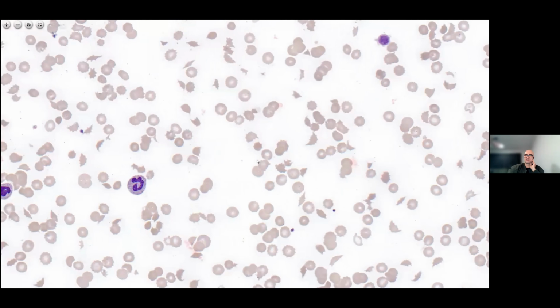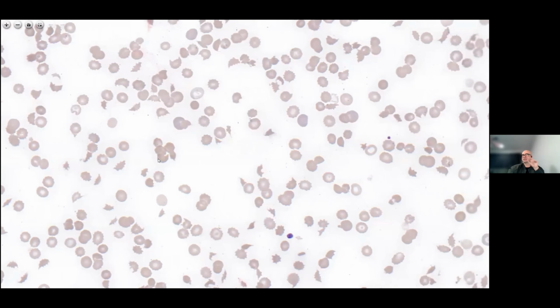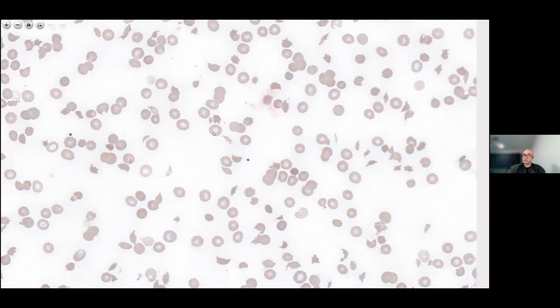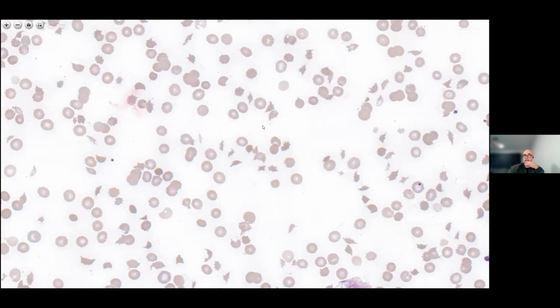Oh yeah, so this looks like an acute process, something that's suddenly onset in a patient, so I wouldn't normally expect to see Howell-Jolly bodies in a film like this. You could see Howell-Jolly bodies in a patient with an acute hemolytic process where the spleen's function is to filter damaged and aged red cells from the body, and it's getting overwhelmed. So you get a small number of Howell-Jolly bodies formed naturally from erythropoiesis in the marrow.